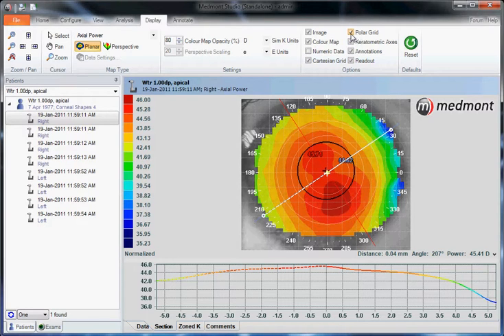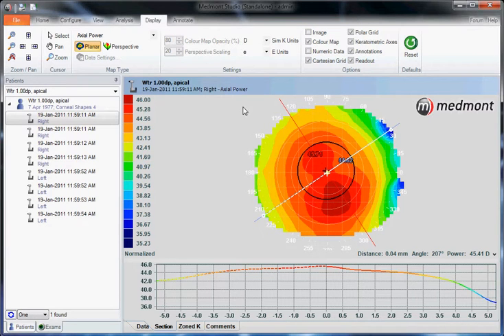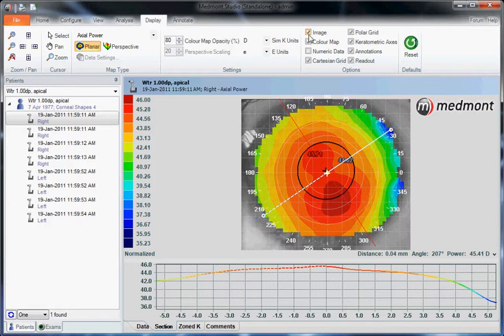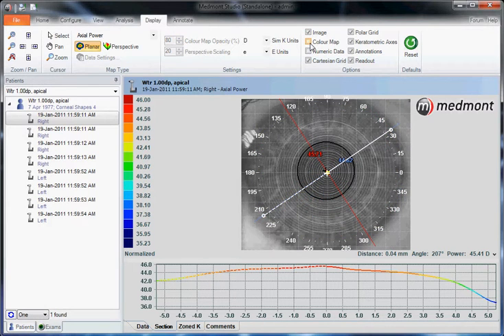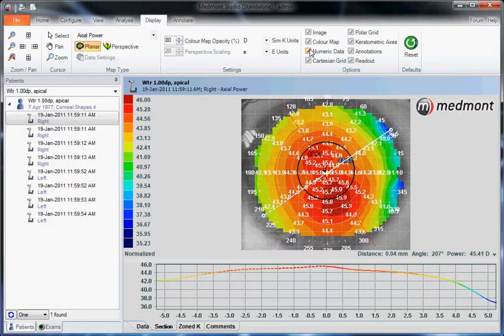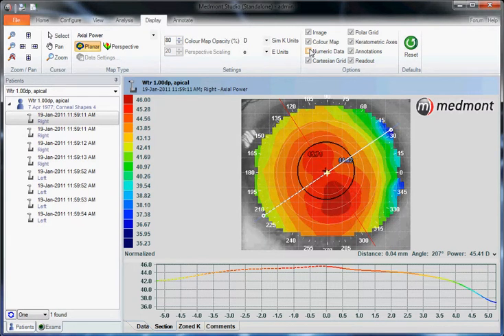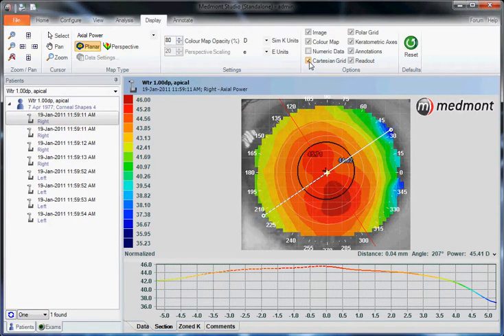These checkboxes allow us to alter what we can see or can't. For instance, if we uncheck the image, that takes away the photokeratoscope image, allowing the view of just the colorized topography. We could uncheck the color to look only at the photokeratoscope image. We could add or take away the numeric meridian data. The Cartesian grid gives us these one-millimeter boxes to determine distance — you can uncheck or check it.